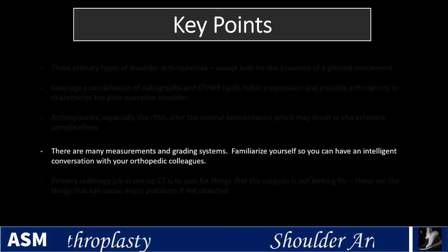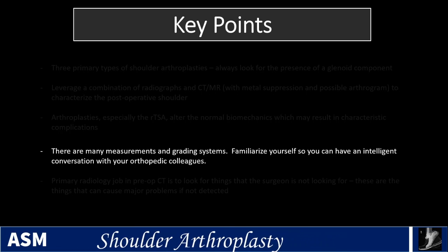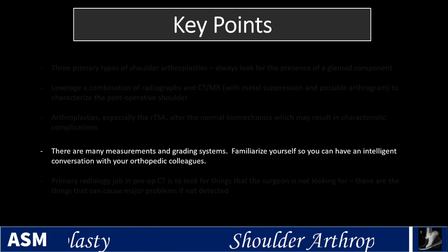There are many measurements and grading systems. You want to familiarize yourself with them so you can have an intelligent conversation with your orthopedic colleagues. They may not want you to use the grading system, they may not want you to make the measurements, but you at least want to be aware of them, so if someone asks you about them, you can talk to them.